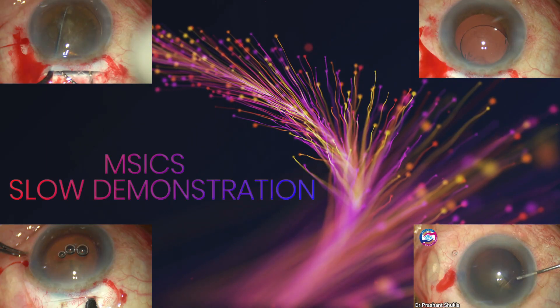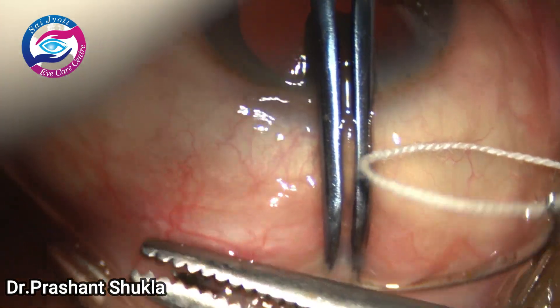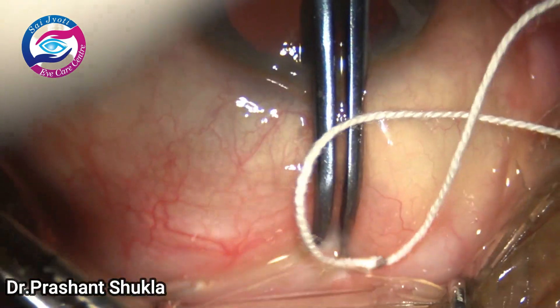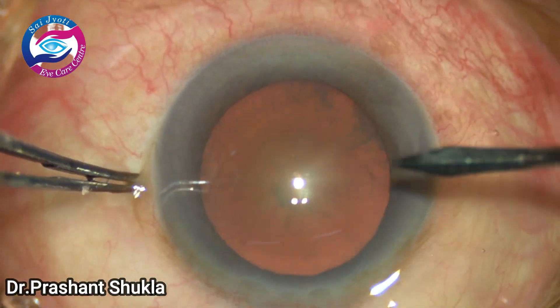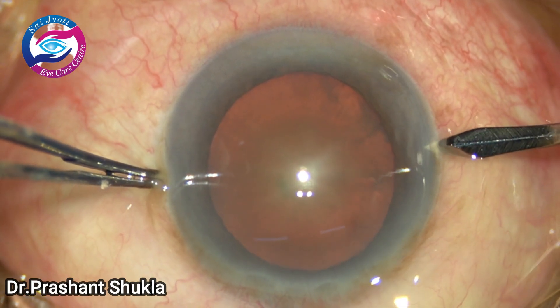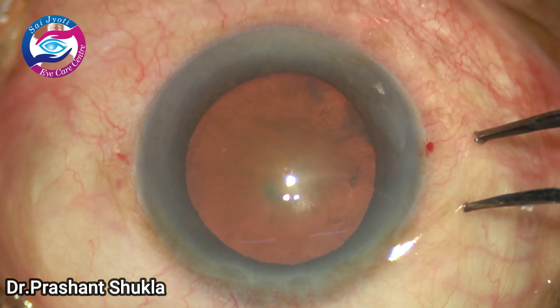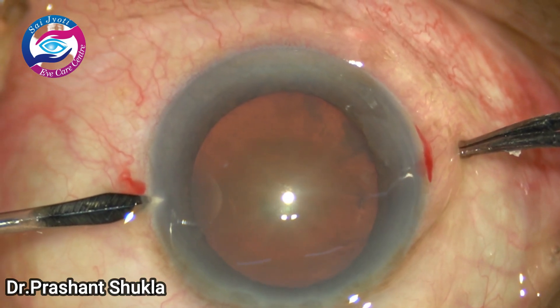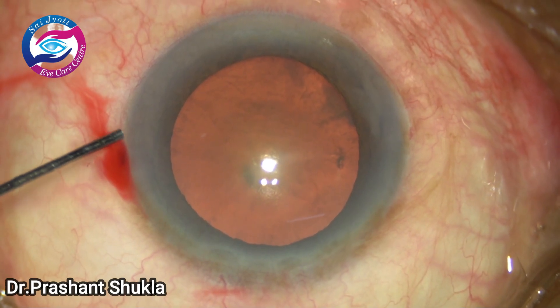Manual small incision cataract surgery — a slow demonstration. This video is intended for surgeons in training and education purposes. Hi, this is Dr. Prashan Shukla. I have come up with a new case in which I have purposely demonstrated the steps very slowly for young surgeons to understand manual small incision cataract surgery and how they can perform their first MSICS.